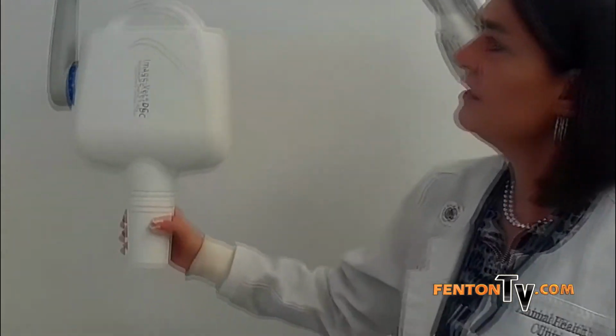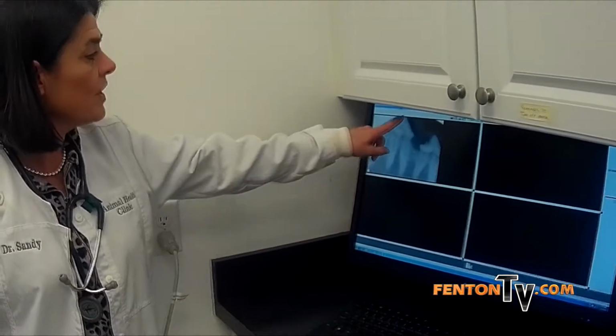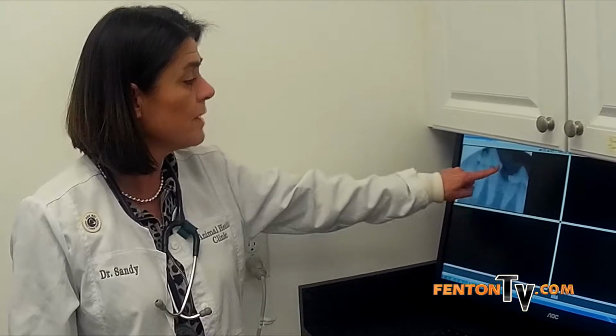If we have any teeth that are questionable, we will then move on to this piece of equipment right here, which is our digital dental x-ray. This allows us to look not only at the external surface of the tooth, but the internal surface of the tooth and all the structures that lie below the gum line, such as periodontal ligaments and teeth root. I'm assuming most of you have had dental x-rays yourself, so you probably know how these work. Once we have taken our dental x-ray, we're going to develop an image. It shows up on the computer because it's digital, and we're going to evaluate the crown of the tooth, the internal structures of the tooth, and the structures surrounding the teeth that keep them healthy and keep them in the jaw.